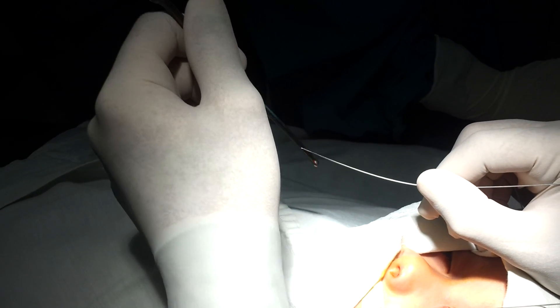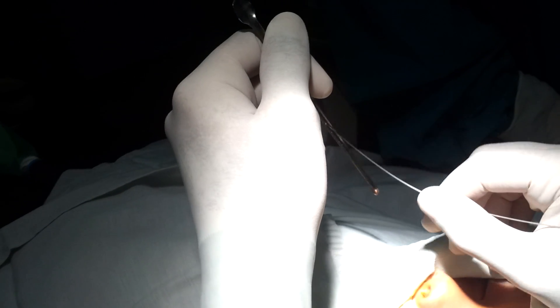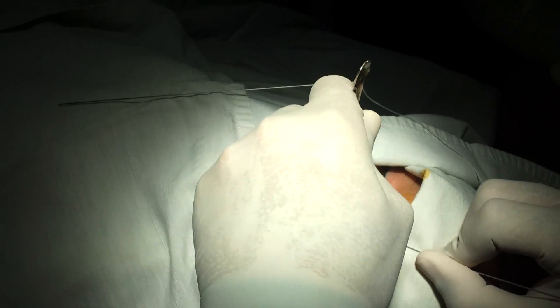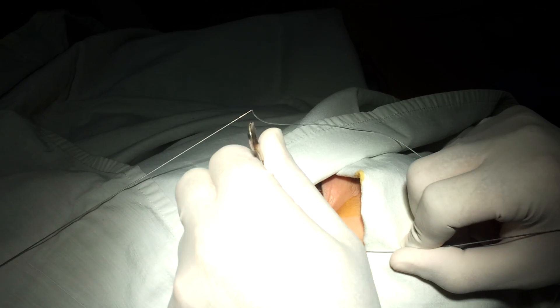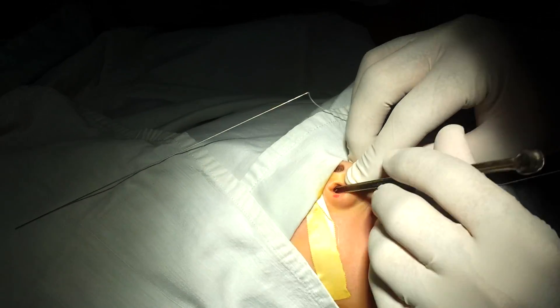Slide up. Once it slides up, this does not move anymore. If they meet like this, you go up until they come here and then you push it a little bit up to manage to bend the wire up and then you turn it up again. So we go down and we meet each other. Here we are — I am sliding against the wire right now, just clicking against the tip end of the wire and my instrument. Now the wire is bent. I go down again and I am taking my wire up, all the way up. And here is my wire.